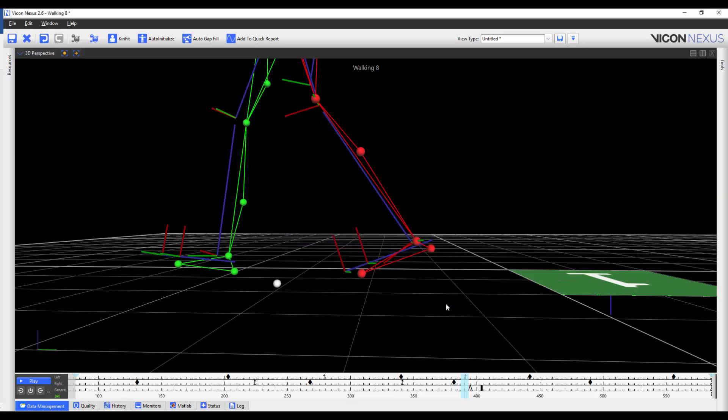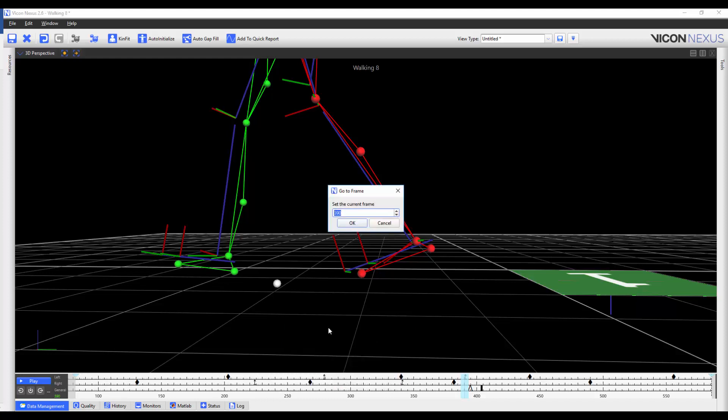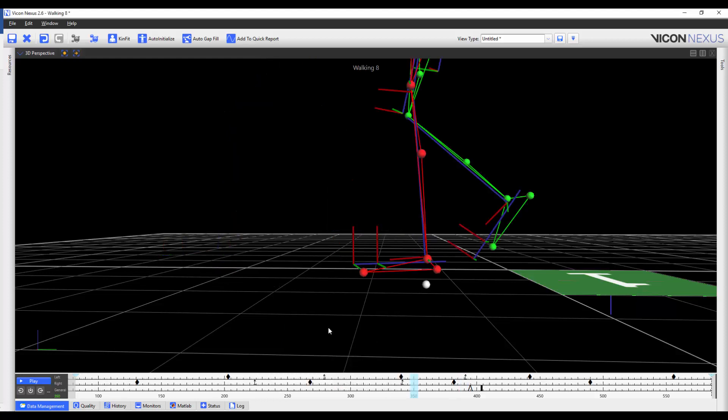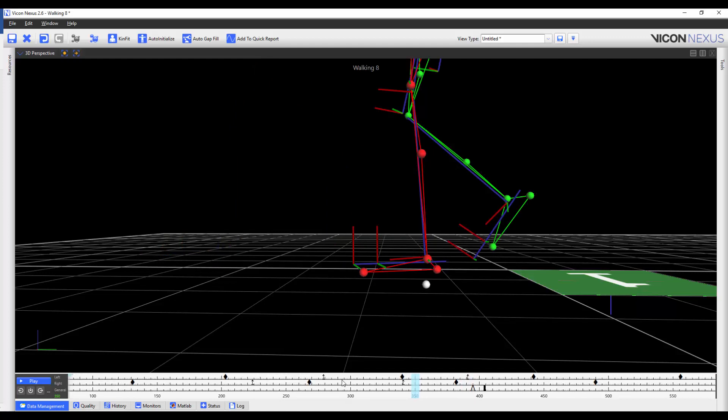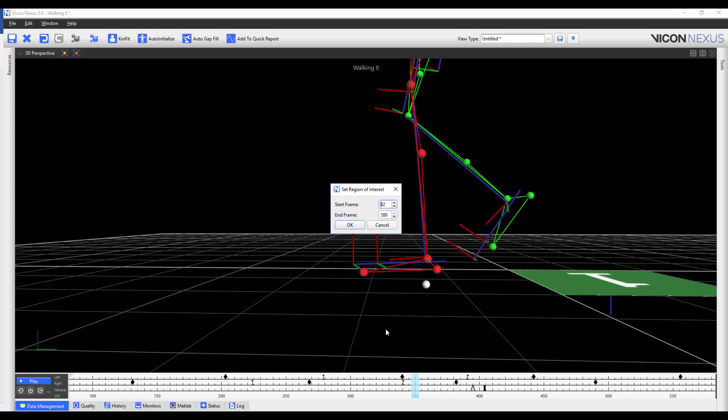You can also specify the region of interest by right clicking on the time bar and selecting Select Current Frame to go to that frame. Or alternately, you can select Set Region of Interest and select the Start Frame and the End Frame.